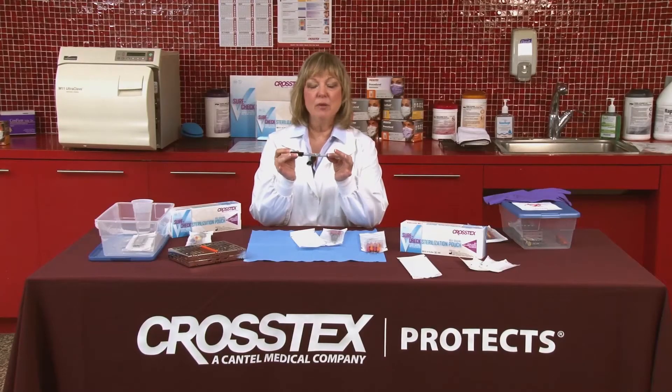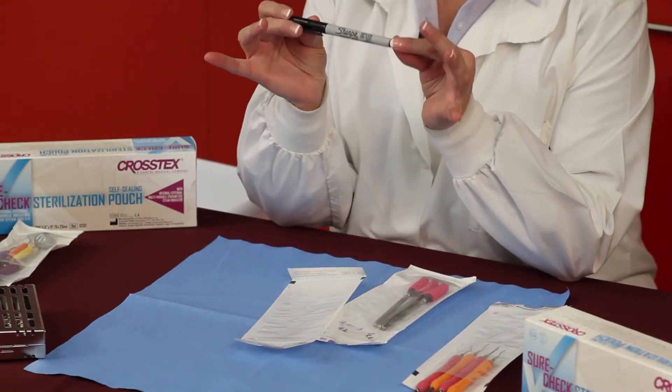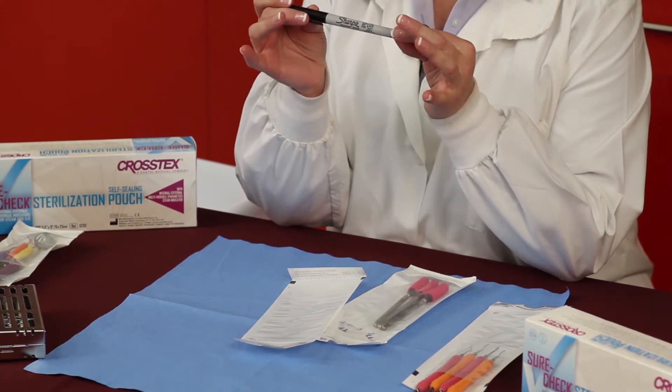There are some companies that manufacture medical grade markers. There is also a number of the Sharpie line that have been identified for use by ASTM standards, and you'll know that if it has an AP symbol in a small circle on the end of the marker.